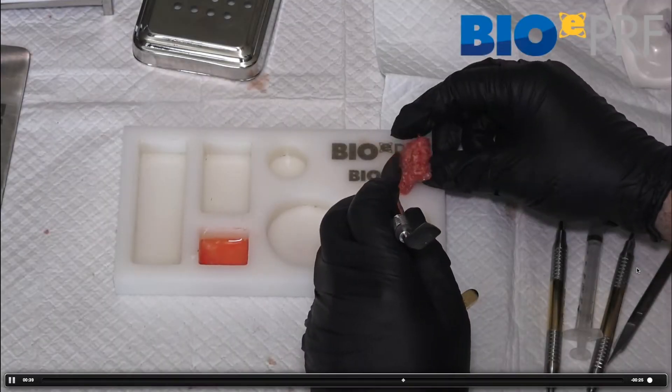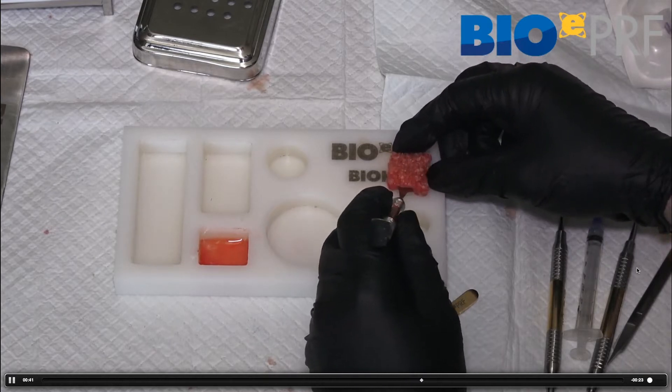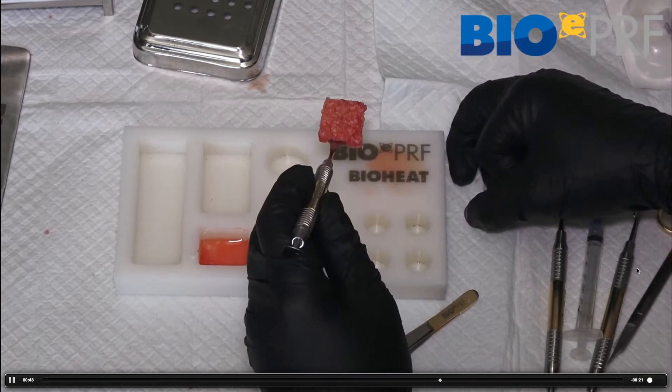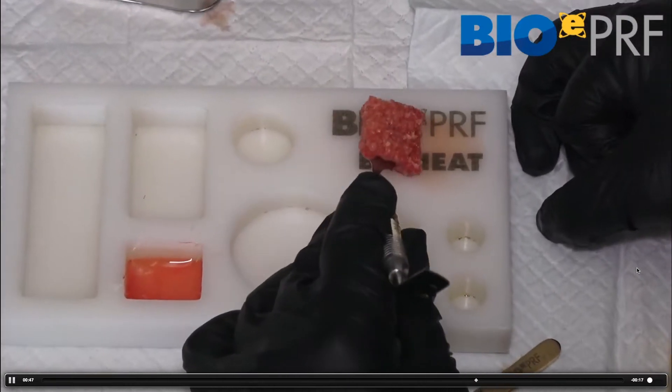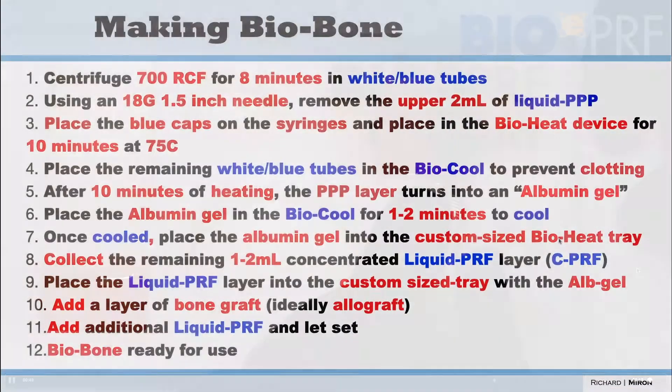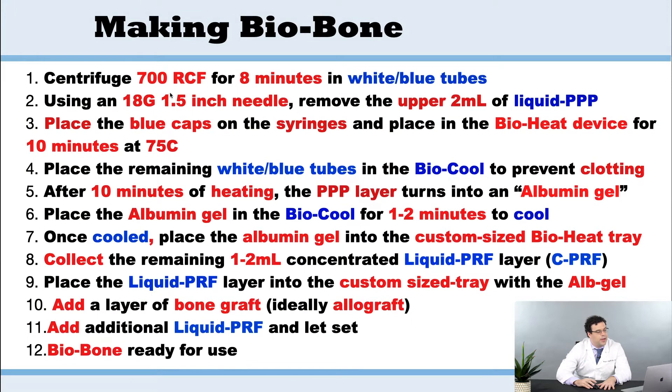When we want to make the biobone, this is very similar to the last step, but all we're going to do now is add some grafting material. It's exactly the same steps as the EPRF, but now we're going to centrifuge for 700 RCF like before, for eight minutes, in the white blue tubes.